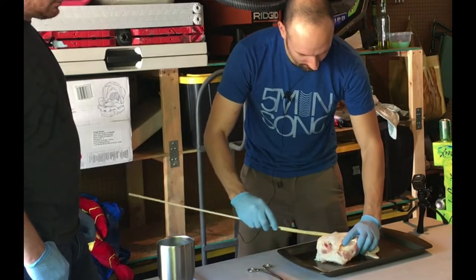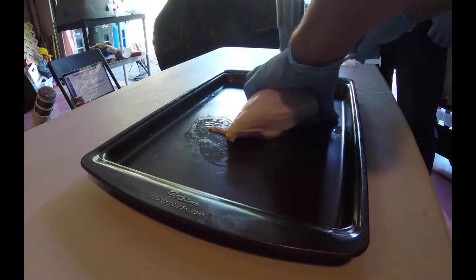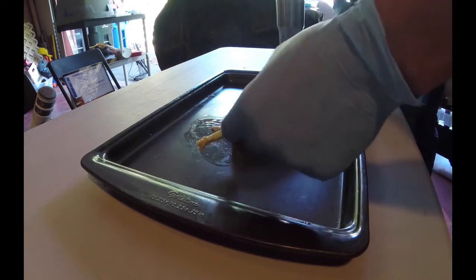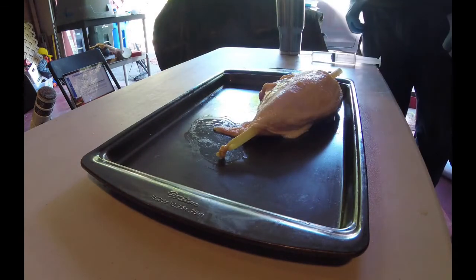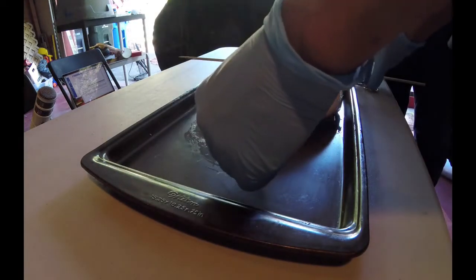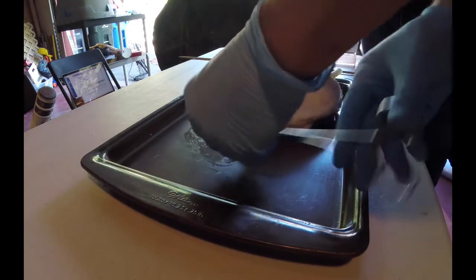And then just kind of whittle it through, just like this, until it pops out the other end, like you see there. Now this end right here, because the skewer has a sharp end, often pierces the latex tubing. So what I like to do is at the very tip of it, I'm going to put a little bit of that clamp there.